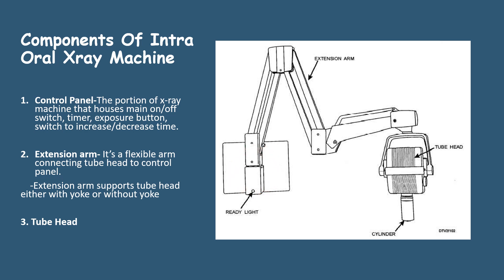The extension arm is a flexible arm connecting the tube head to the control panel. It supports the tube head either with a yoke or without a yoke. This is the extension arm and this is the yoke.